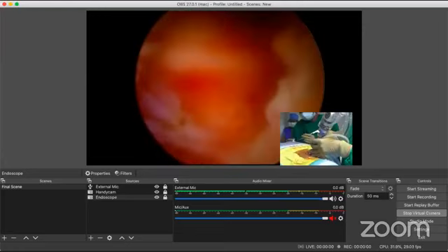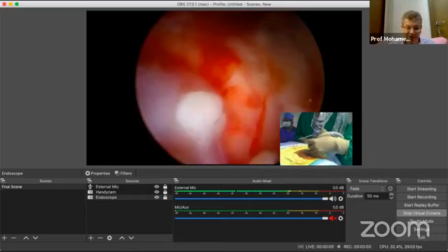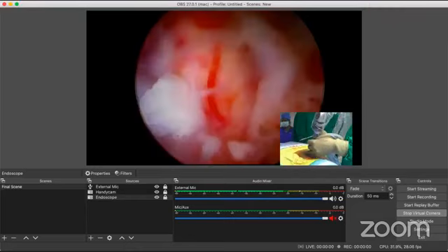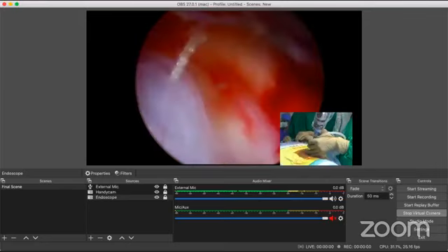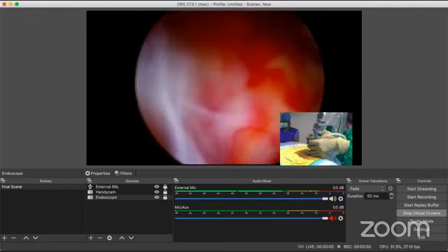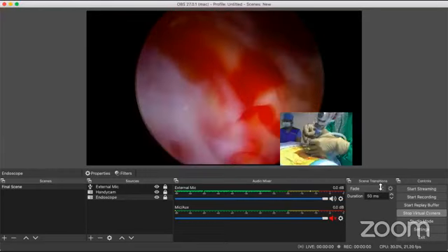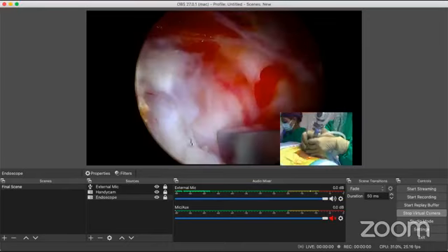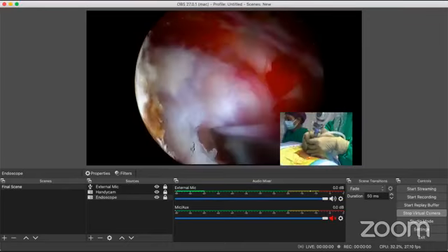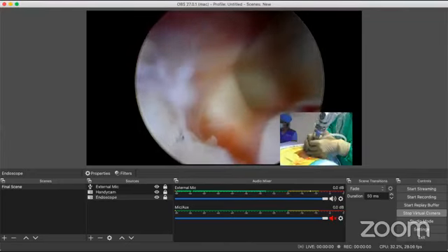I hope you, my friends, have enjoyed this surgery. Okay, you can see the beautiful root here, completely exposed. Can I have a dissector, please? One minute. I think I can show you the osteophyte also because we have stripped it now. So yeah, this is the osteophyte, guys. This is a huge osteophyte.